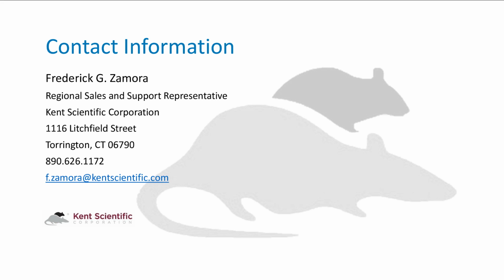Great. Another question here concerning personnel safety. I see we're using the device on a tabletop. Is this device safe to use with only the canister? And have you tested it with monitoring badges?